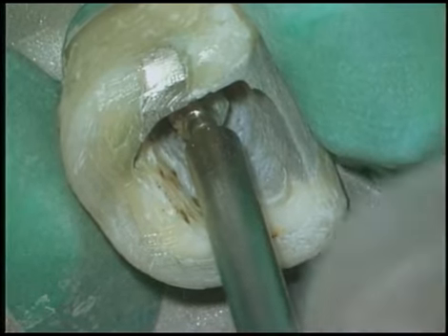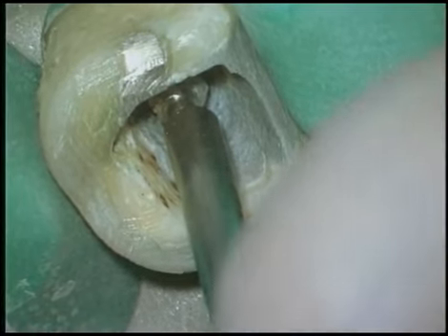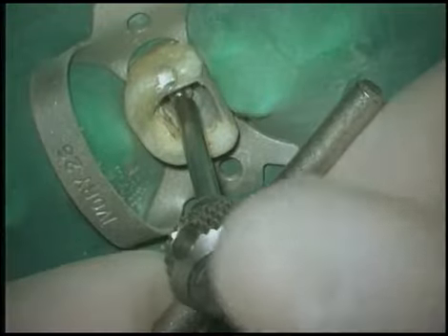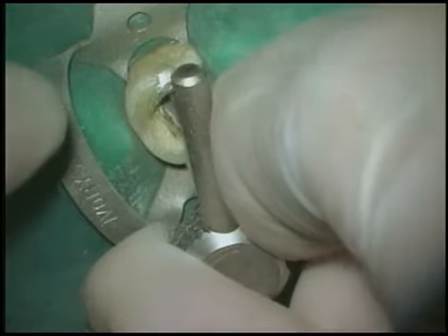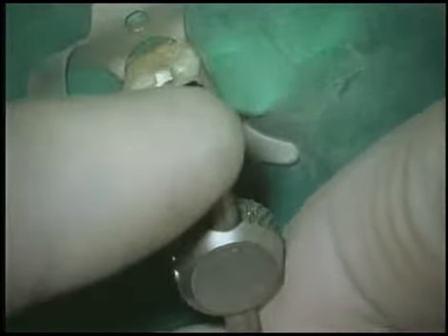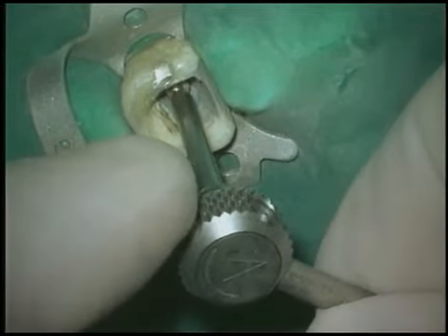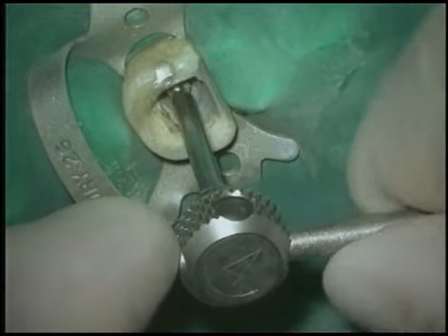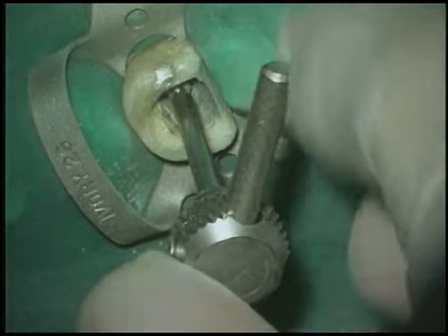A tubular tap is placed on the head of the post, and as we go through counterclockwise turns, the tap is pulled down over the post and tightly engages it. To facilitate moving the tap handle in a counterclockwise motion, we use a torque bar. Notice that we're going very slowly and progressively and not rapidly overstressing the post.